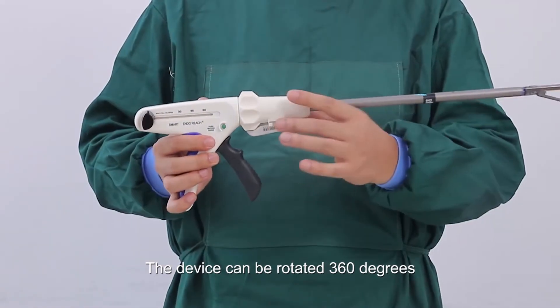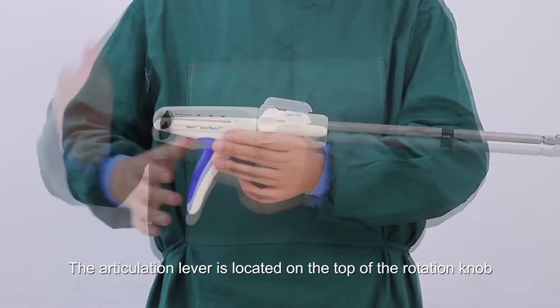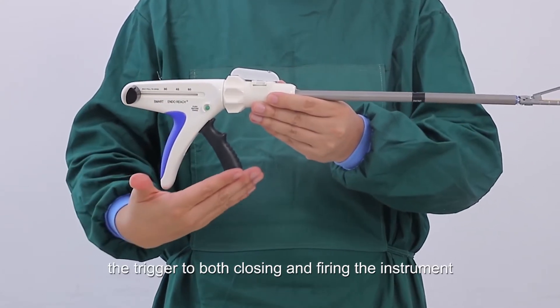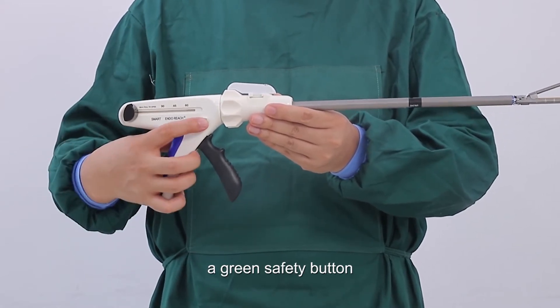The device can be rotated 360 degrees. The articulation lever is located on top of the rotation knob. The backside of the instrument is where the handle is located. The trigger is used for both closing and firing the instrument. The return knob is located on both sides, and there is a green safety button.